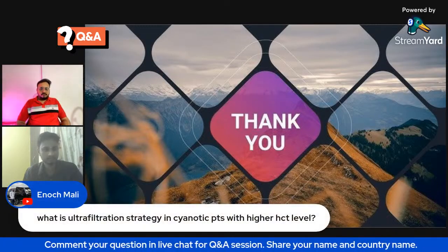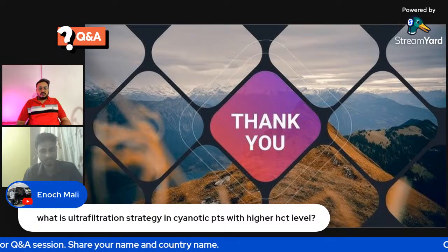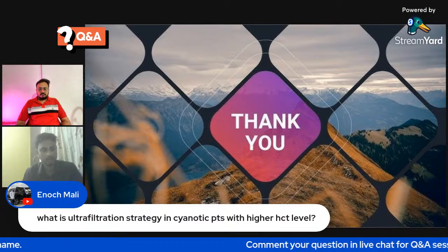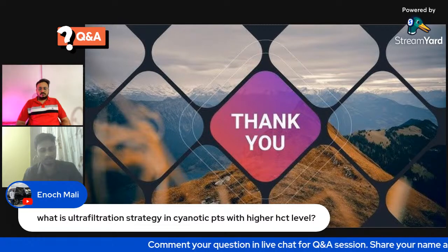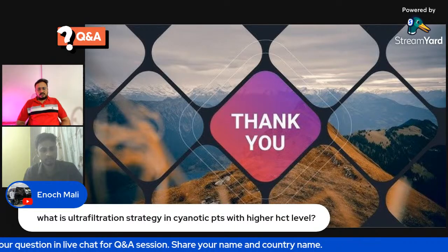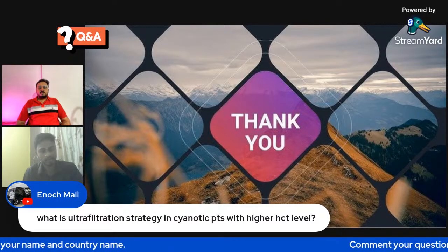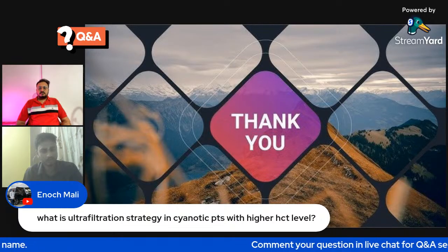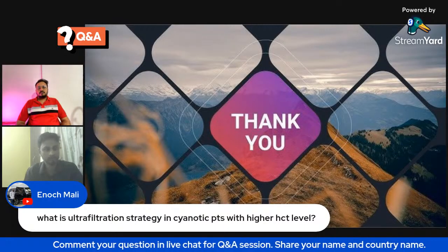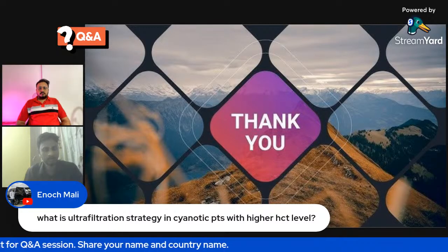So we have one more question. What is the ultrafiltration strategy in cyanotic patients with higher hematocrit levels? For higher hematocrit levels, we use ZBUF. ZBUF is beneficial because we are administering cardioplegia. Also, FFP and other products we use for priming, and some inflammatory mediators will be released. So ZBUF is a benefit for higher hematocrit levels.